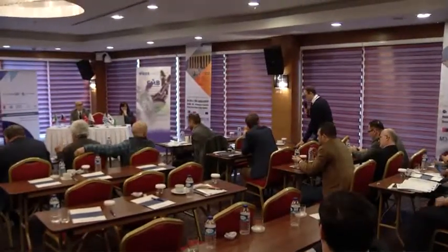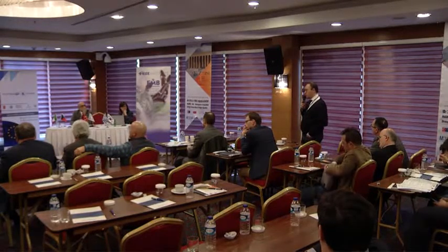Thank you for your presentation, sir. I want to ask some questions on hilum dissection. I did my residency in a center where using Hem-o-lok clips for hilum dissection was standard, and during my residency period I never saw any nephrectomy using staplers in the hilum. But anyway, using Hem-o-lok clips, even the original ones, is contraindicated in donor nephrectomy by the FDA. Any patient loss because of hilum bleeding can be a matter of prosecution.